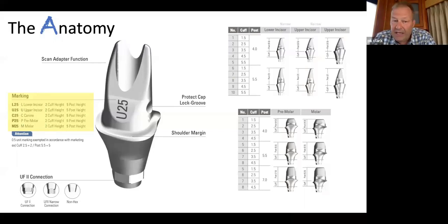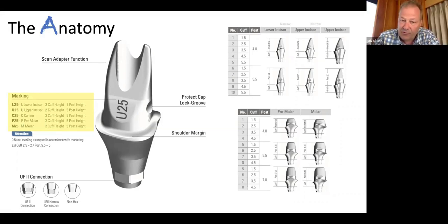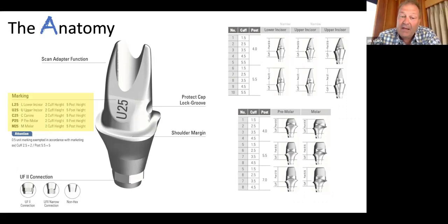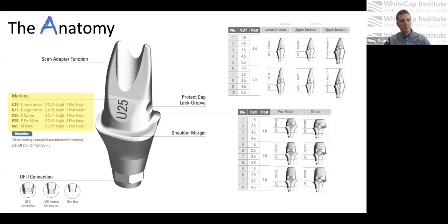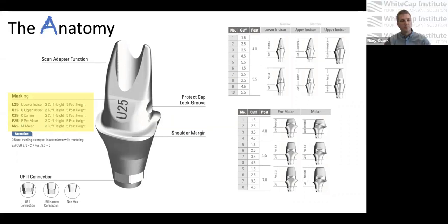When you put it back in, make sure anytime you take a custom abutment, a healing abutment, or anything out — you immediately take a cotton two-by-two with alcohol on it and get rid of the biofilm. If you put it on your workbench for five minutes, it's going to have dry biofilm. So make sure you're cleaning it really well as soon as it gets out — that's your dental assistant's job. Then do the ISQ — it's 75 and you feel better. Now numb the patient up, take a diamond burr and rough up those tissues that were no longer attached, refreshing it up, make sure that's sterile, put it back in and you're probably back to where you were.